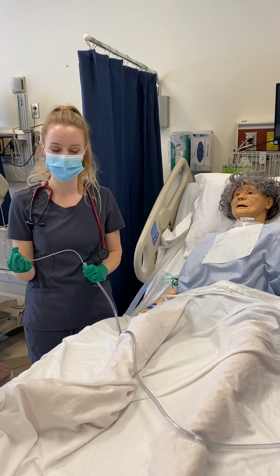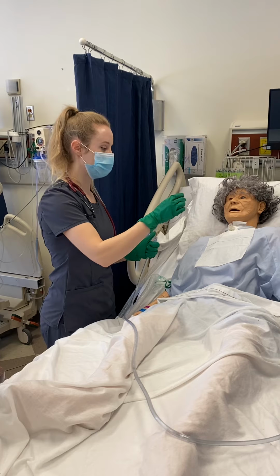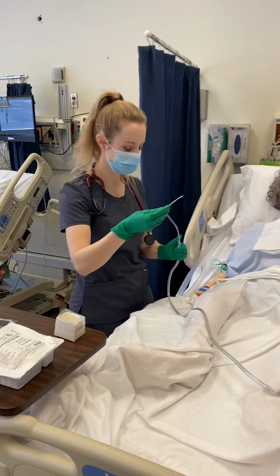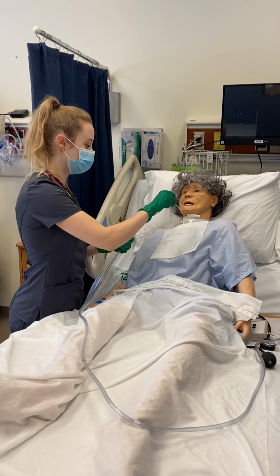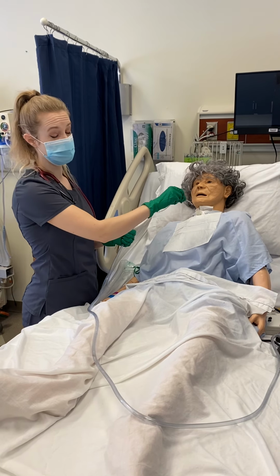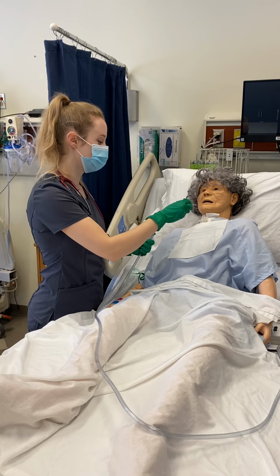I will once again lubricate my suction catheter in my saline and insert. Before this, I have also established a nonverbal form of communication if my patient is experiencing distress.